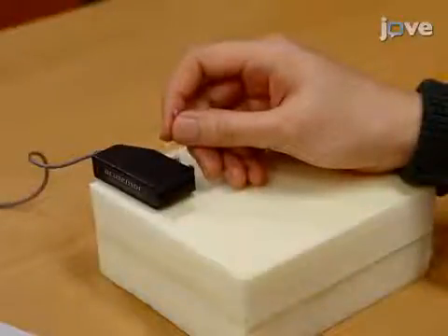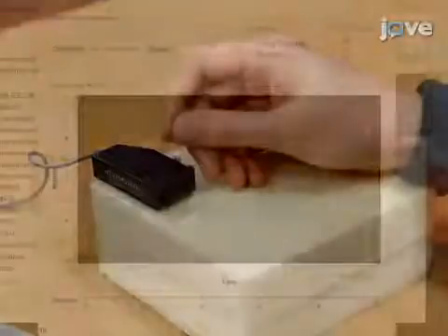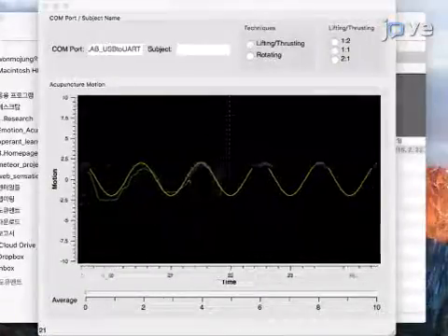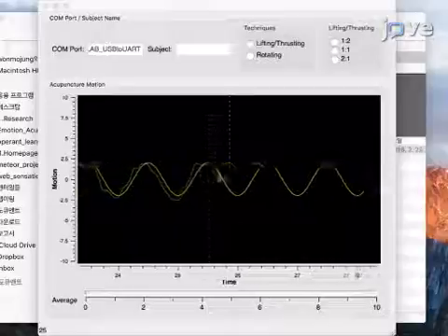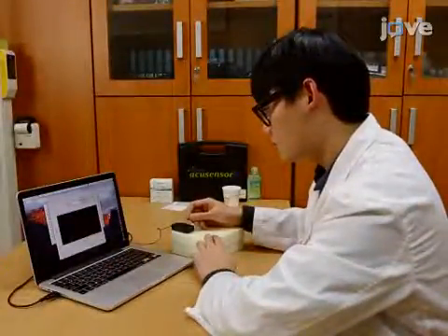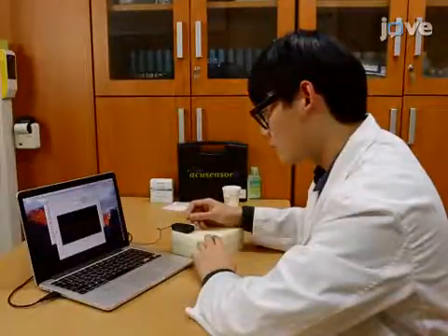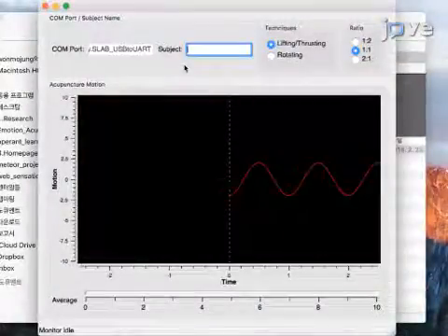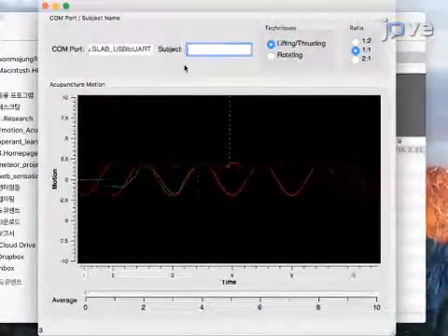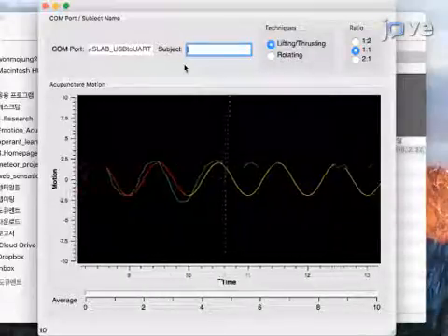Then, manipulate an acupuncture needle on the phantom acupoint for about one minute, while the actual movement of acupuncture manipulation is being measured. Have the participant look at the screen as they manipulate the needle to view the actual movement of their acupuncture manipulation concurrently, along with the intended movement. As shown here, the transmitted actual movement is displayed as the green line, and the template of the intended motion is concurrently overlapped as the red line.